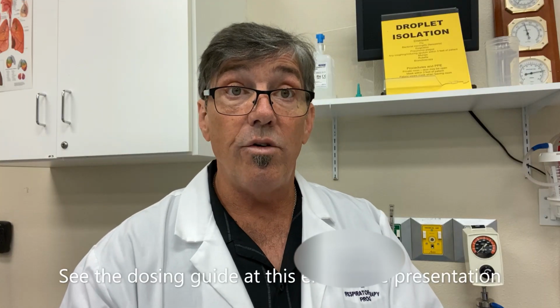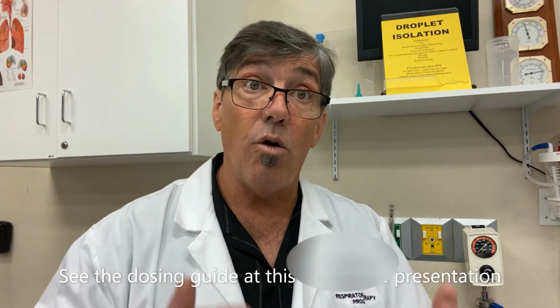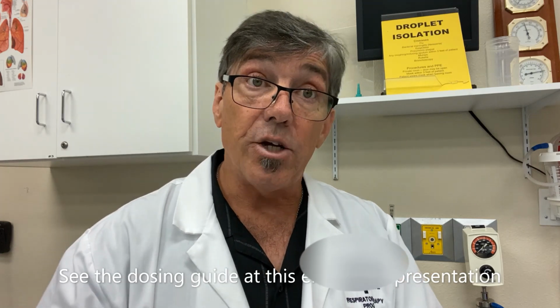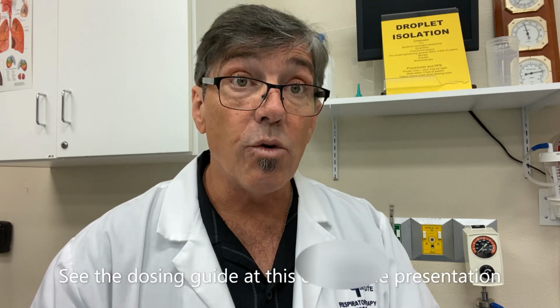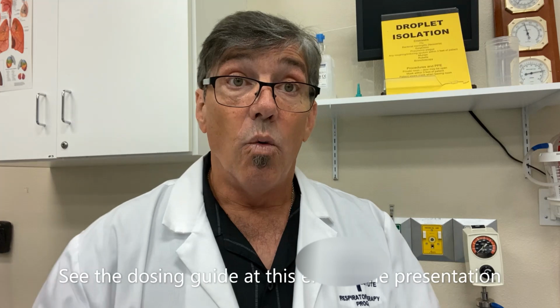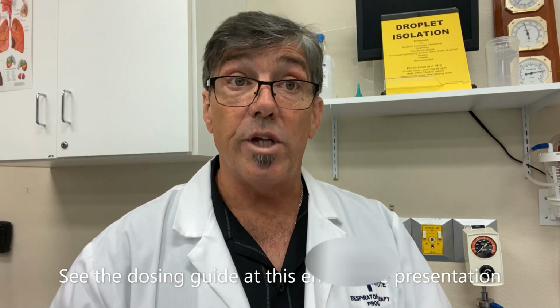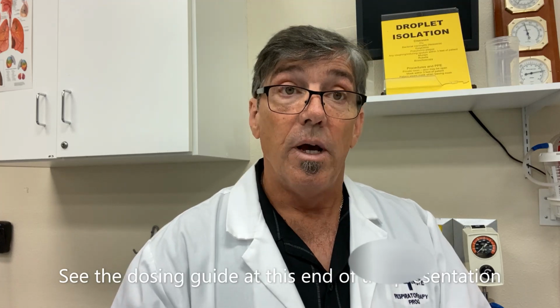The other thing you want to do, if you are going to mix this medication at the bedside and utilize the Hope nebulizer's package insert, which includes dosing, again, I would recommend highly that you have another RT or an RN work together with you to ensure that you're providing the right concentration, whatever the physician has ordered. Nursing oftentimes does a two-system check where two nurses are looking at the system to make sure that the concentration that you've mixed is appropriate.